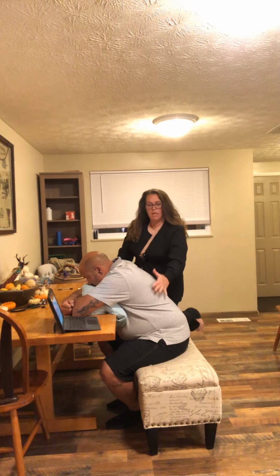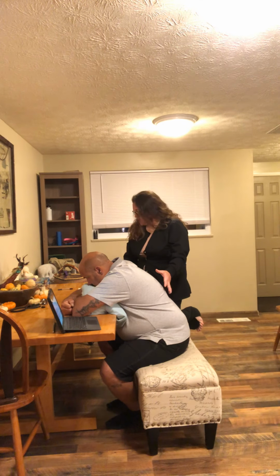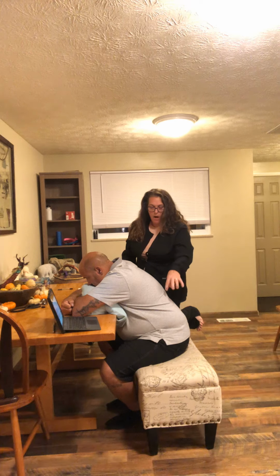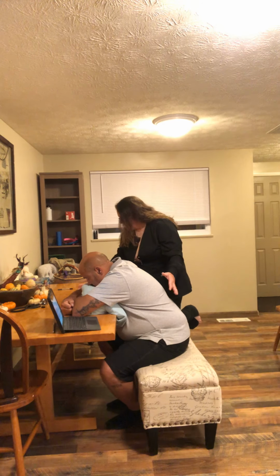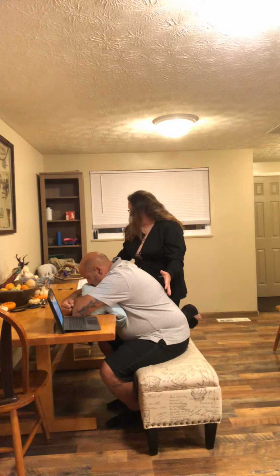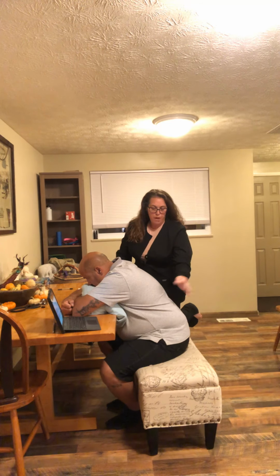If we're doing this here on this area for therapeutic purposes, we're going to have a stopcock on there and have that into a drainage system to be able to drain that 1,000 to 1,500 milliliters of fluid passively into our vacutainers.